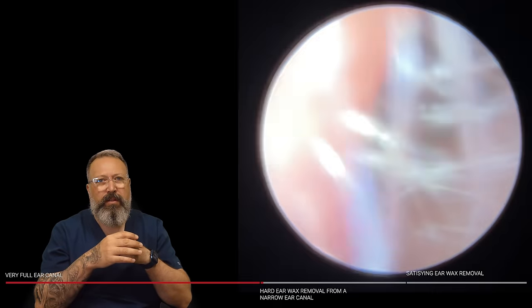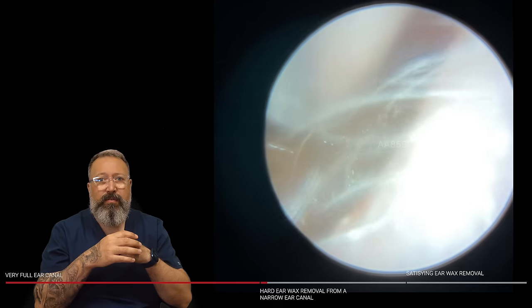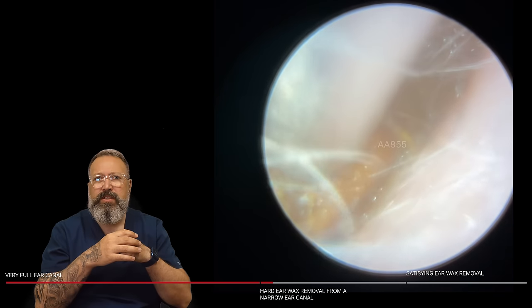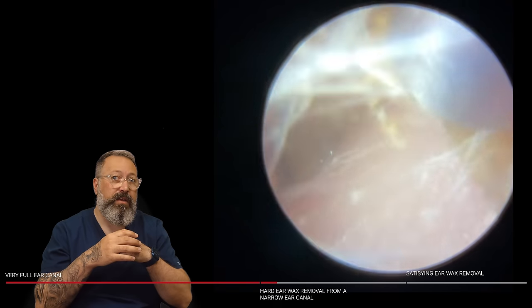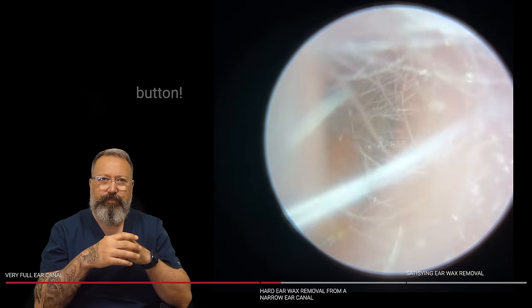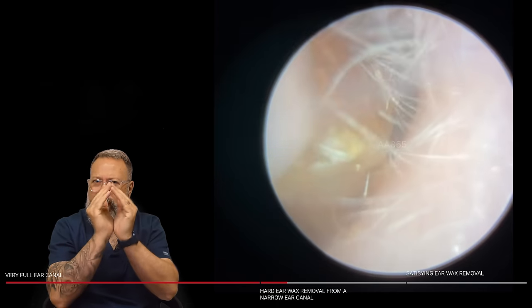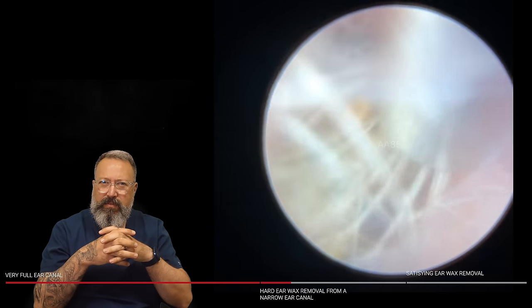Quite a soft wax this one as well, by the looks of it. Now, this one I can't remember because I probably did this about a week ago. Let's have a look — is it soft or is it hard but just with a bit of a sheen? Oh, it's hard with a bit of a sheen to it. Well, this looks like it's coming away well. I don't want to jinx myself, but it looks like it's coming away nicely. Slightly narrower ear canal here. A harder bit of wax — we did get a good grip but as we started to pull it through, it just sheared off. It looks like the canal just narrows a bit at the entrance, which means we've got to fight through this.